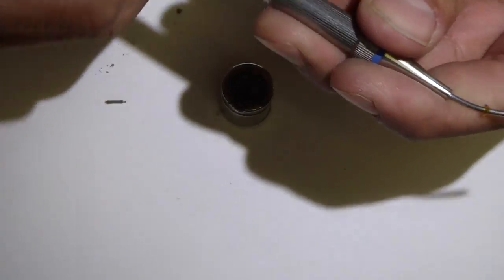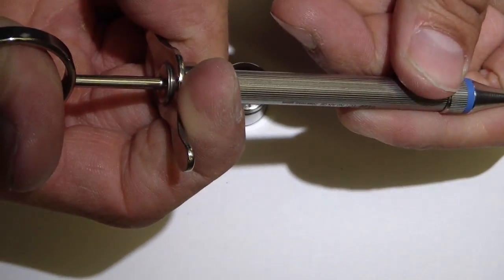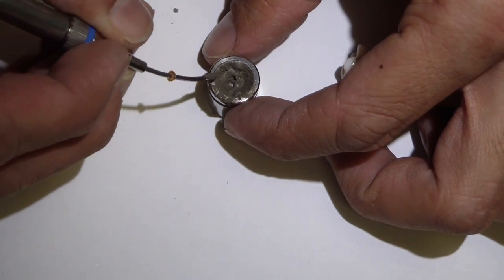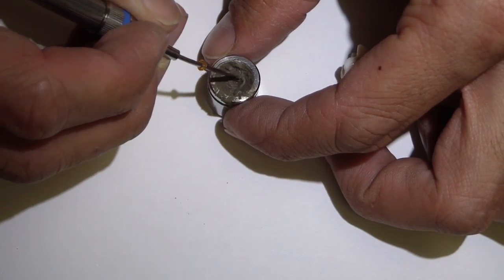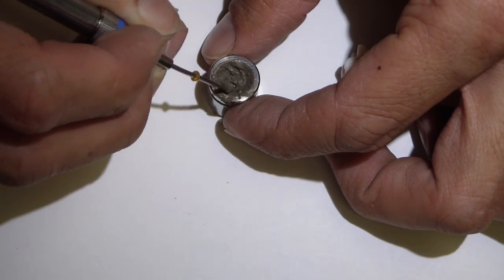So I'm going to make sure when I hand this back to my dental assistant, I pulled back the piston. I'm going to fill this. Now you can see how some of the moisture has been evaporated. It's just almost perfect.